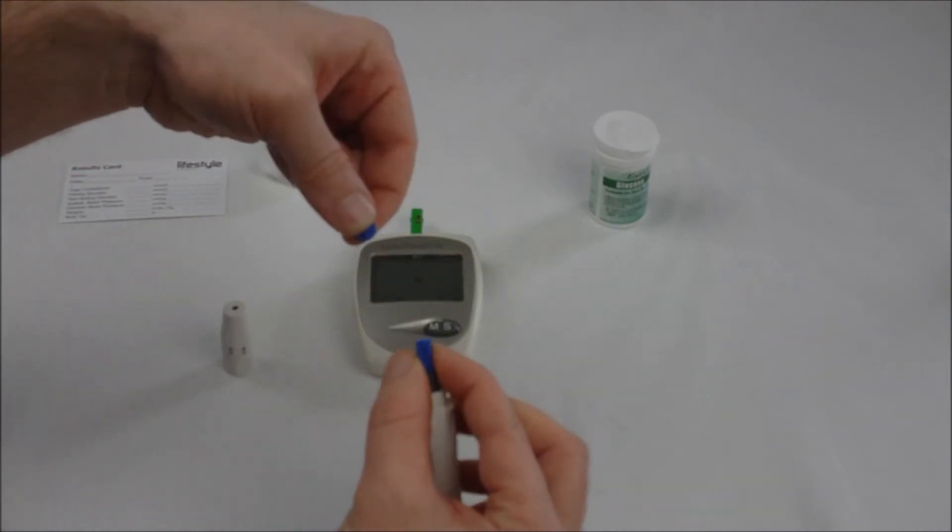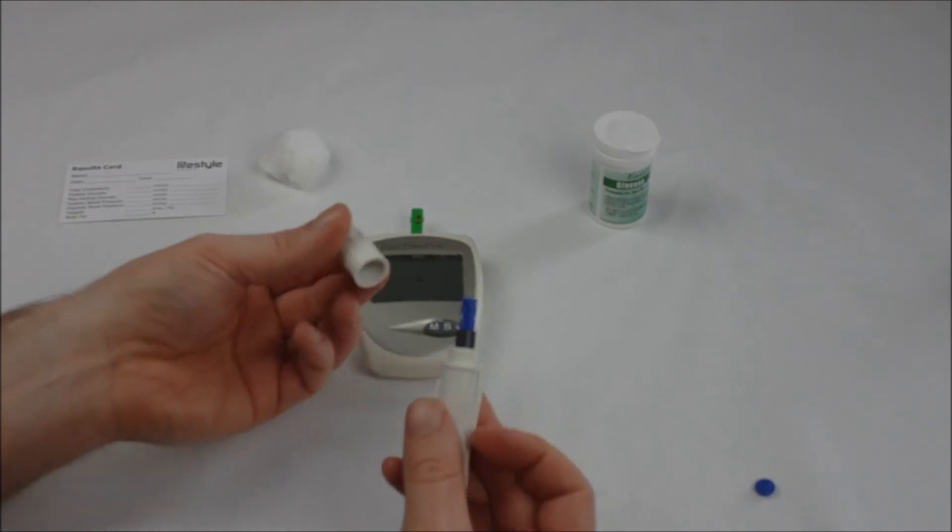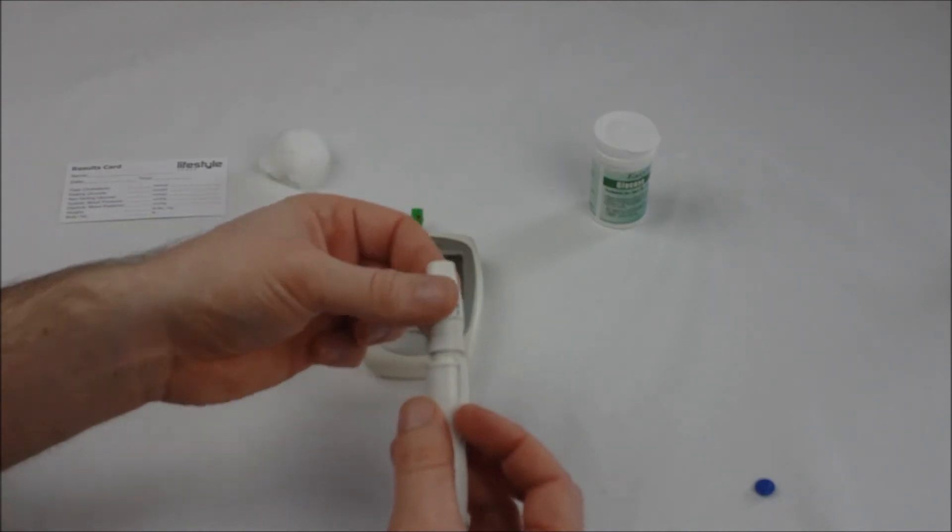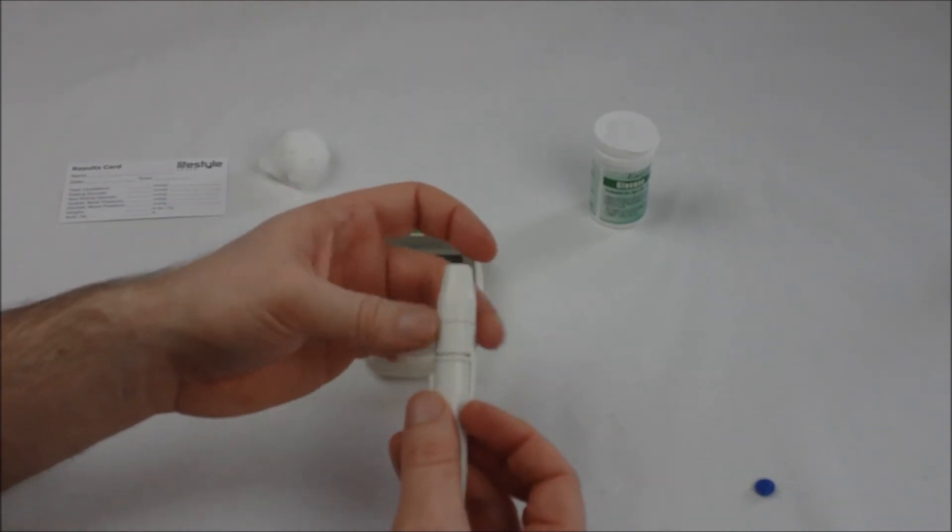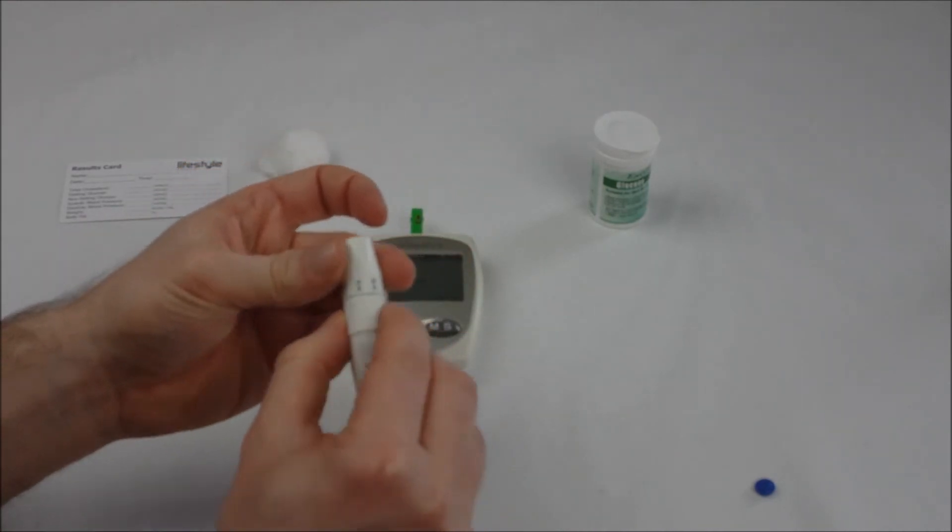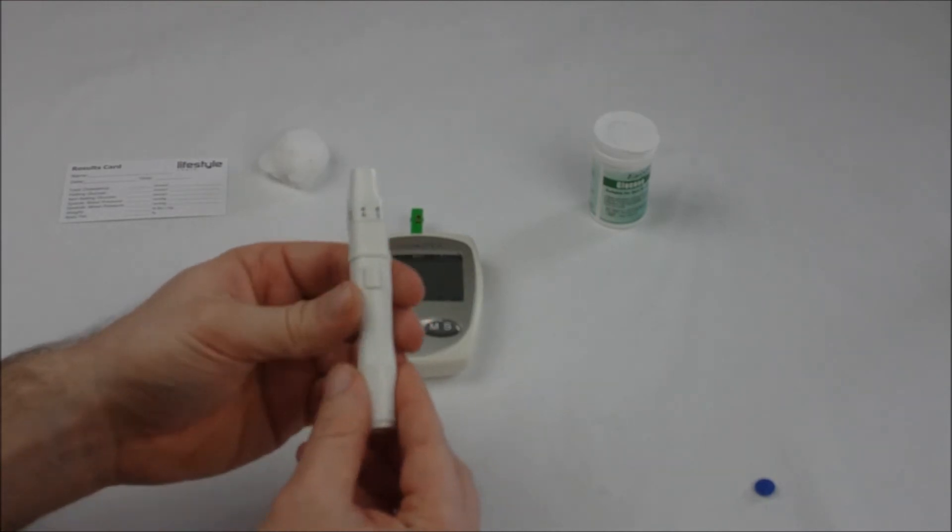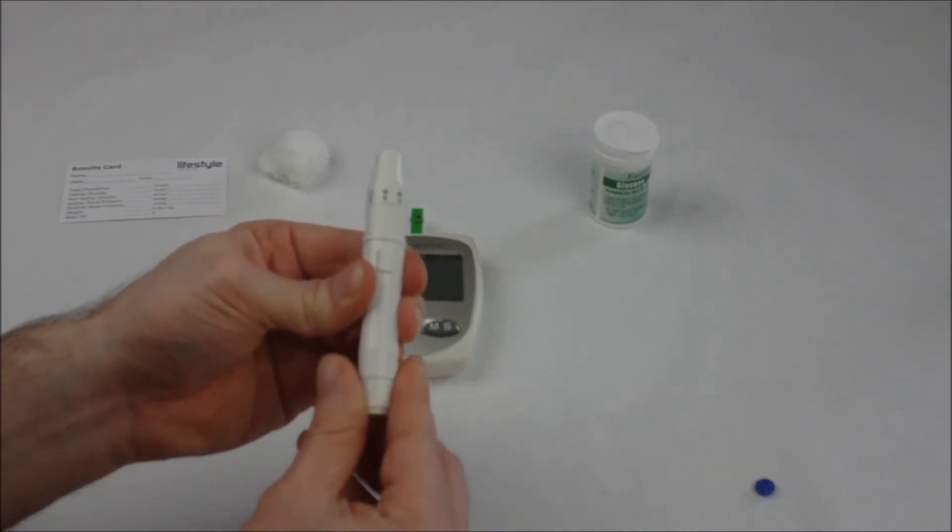Twist the circular cap off, exposing the needle, so take care at this point. Then re-screw the top of the lancing pen back on, select the depth setting that's appropriate to your skin, and engage the pen by pulling back.